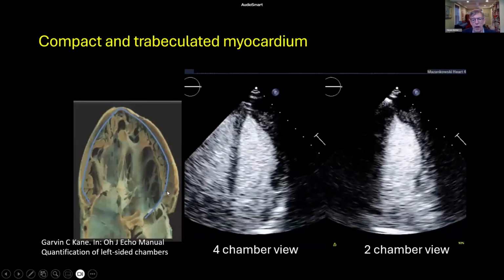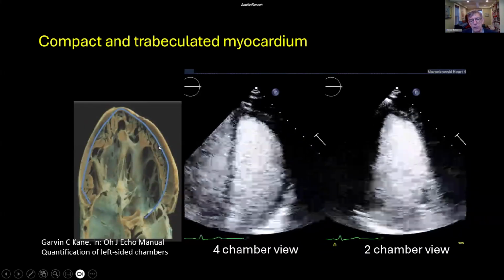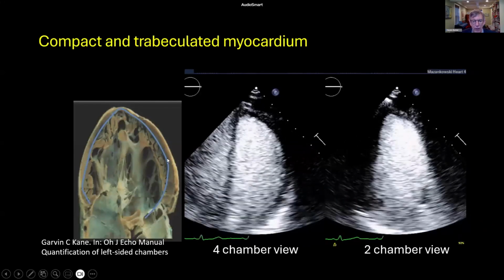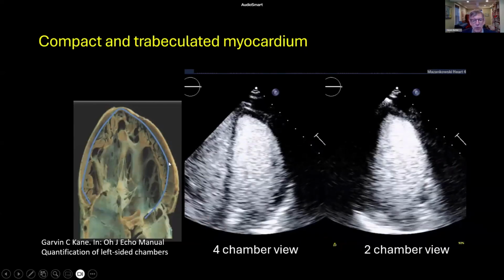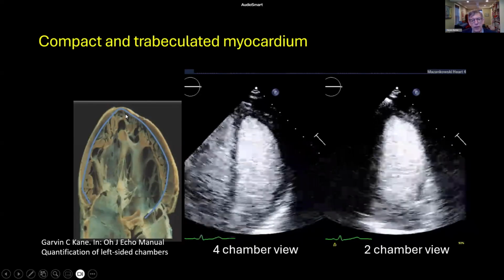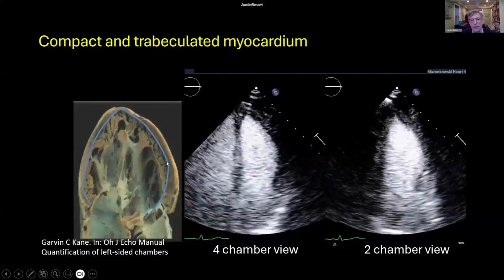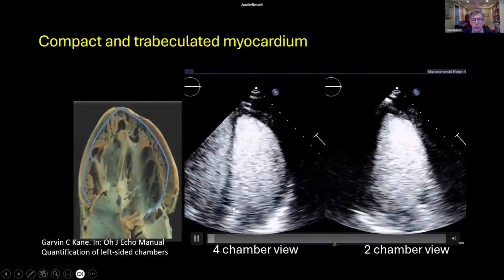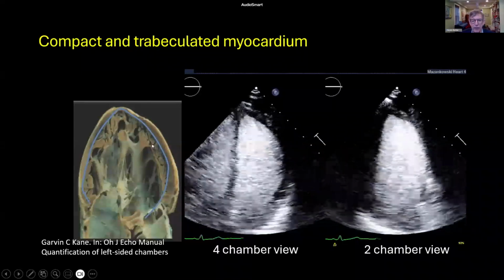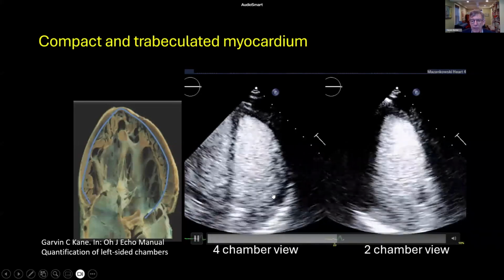It's tricky because of the anatomy of the LV wall. You can see here on an anatomic specimen that we have 2 layers. The compact myocardium, and that's what we want to see, because that's where we can see thickening and inward motion most easily. But that is often obscured by trabeculations, mainly in the apex, in addition to the noise which we often have in the apex and here in the lateral wall. Contrast agents, or as we call them today, ultrasound enhancing agents, can help us because they fill the gaps between these trabeculations and make it easy to follow the border of the LV cavity.